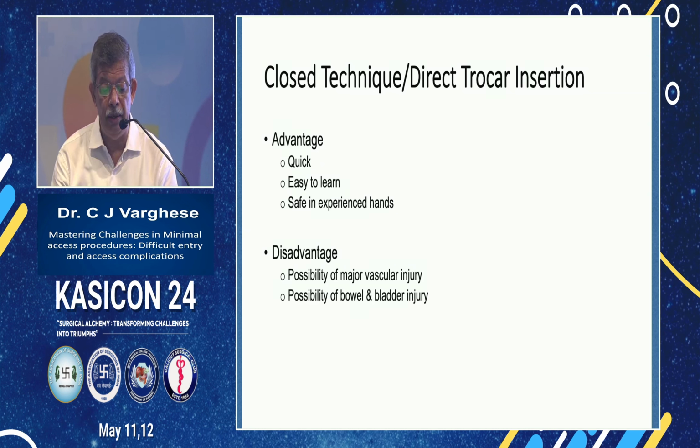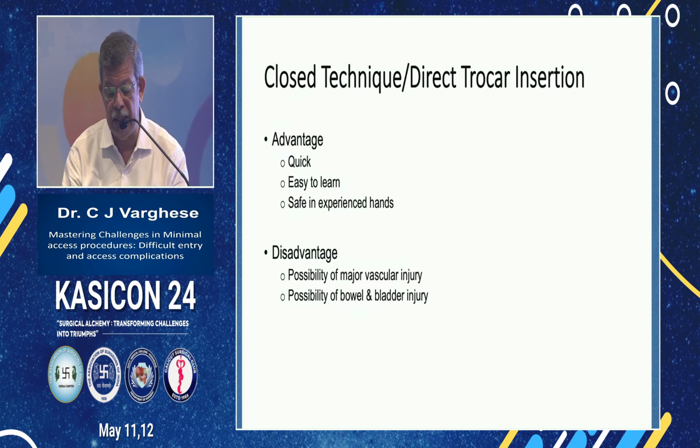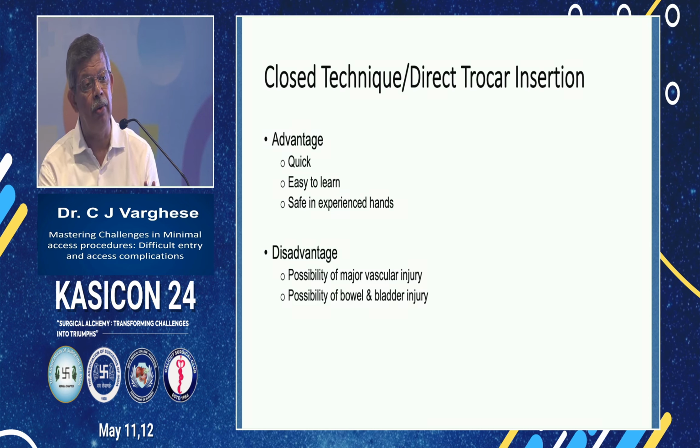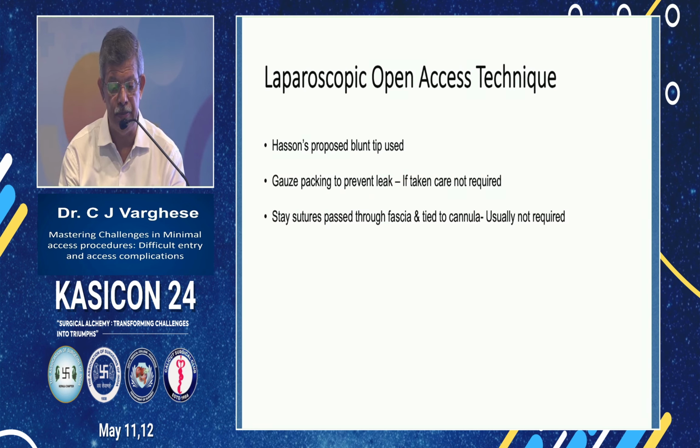So here there is a possibility of making a very major vascular injury or bowel or bladder injury. So that is a drawback. Otherwise, in expert hands, it's found out that this technique is also safe. The complication rates are also similar to the other methods.